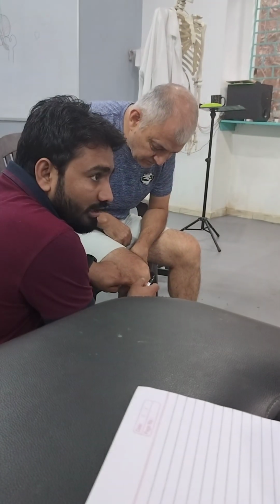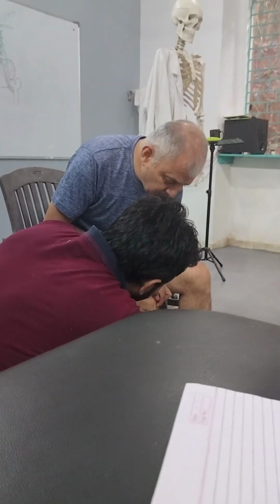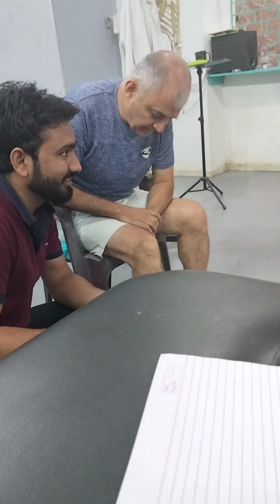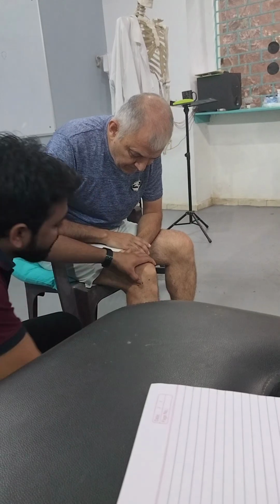For example, this is the patellar tendon. Next to the patellar tendon, on the lateral side and on the medial side, these are two needles. These two needles we use for the cartilage inside the knee. When we come to the lateral side, we check the joint, and here are two to three needles.